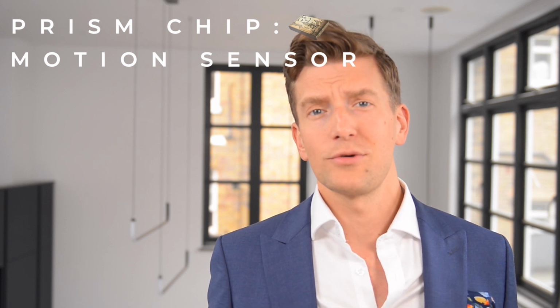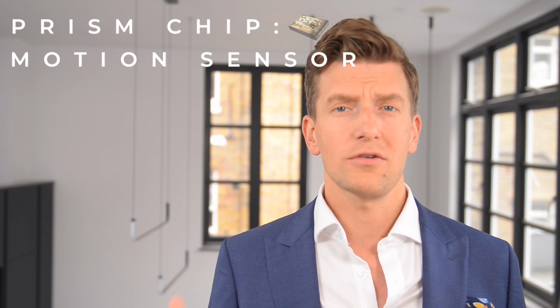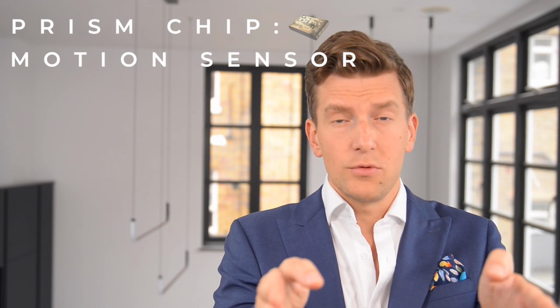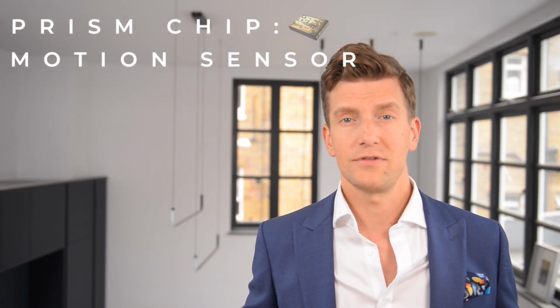But if you're walking and talking to somebody, more often than not, they'll be to your left and your right. So of course, you want the microphones on the hearing aids to be able to sense that. So instead of it picking up what's in front of you when you're sat at the table, it'll give you a little bit more information in terms of what's going on to your left and to your right.